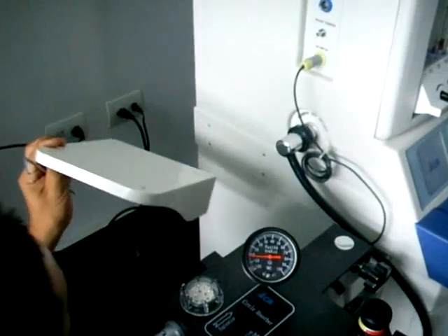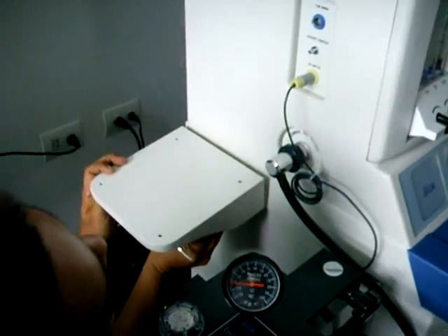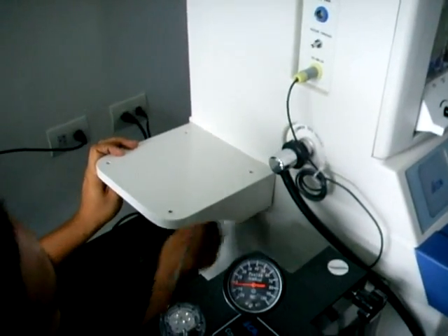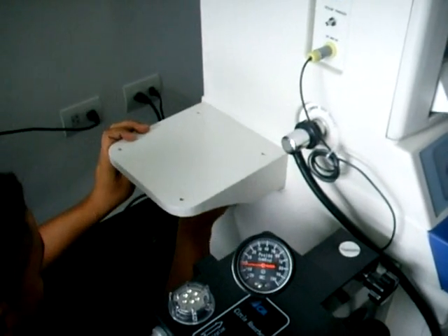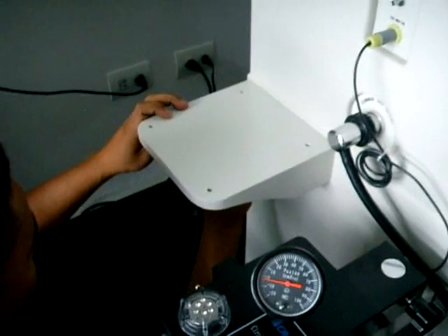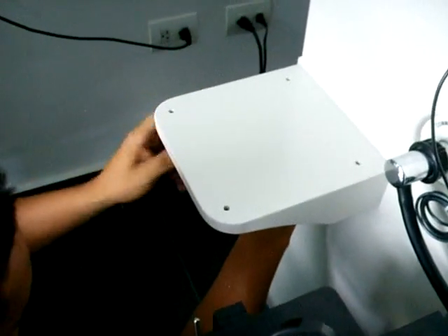Procedemos a realizar la instalación de los cuatro tornillos en la parte lateral de la máquina. Debemos asegurarnos que estos queden completamente introducidos, ya que esto garantizará que el fuelle quede completamente quieto al momento de empezar a ejecutar sus funciones.